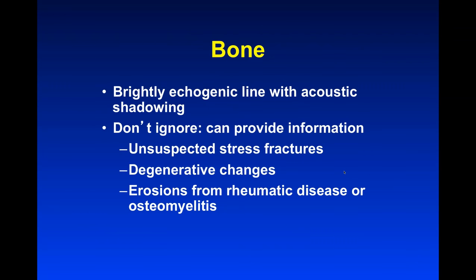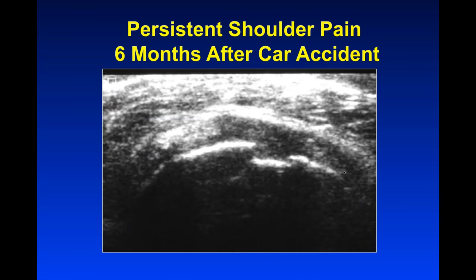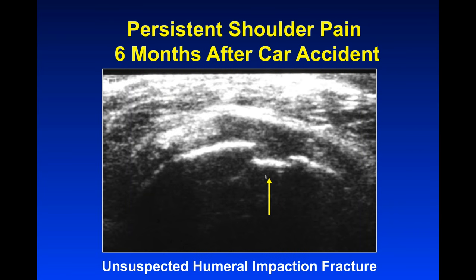Bones are brightly echogenic lines with acoustic shadowing. Don't ignore bones — they can provide important information. You may see unsuspected stress fractures, degenerative changes, and erosions from rheumatic disease or osteomyelitis. This is a woman with persistent shoulder pain six months after a car accident. Her initial x-ray was negative, and she couldn't have an MRI because of claustrophobia. We did not find a rotator cuff tear, but the patient pointed to where she hurt and we placed the probe there — revealing a depressed piece of bone: an unsuspected humeral impaction fracture. These are very hard to see on x-ray. Ultrasound saved the day and she could then be treated properly.